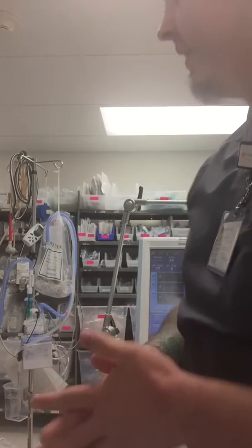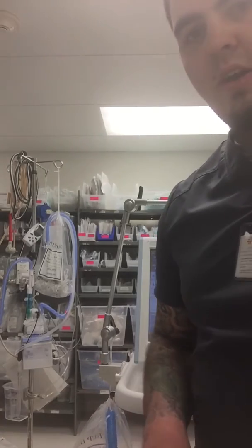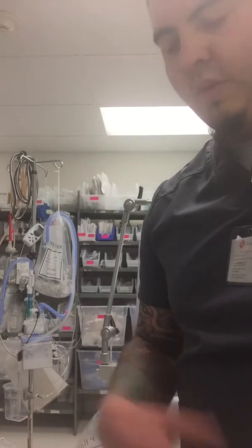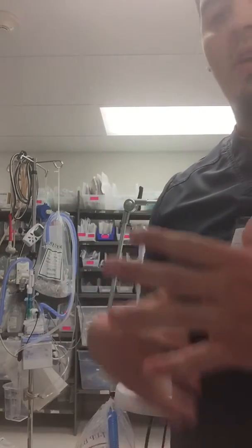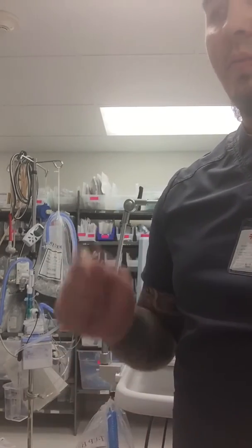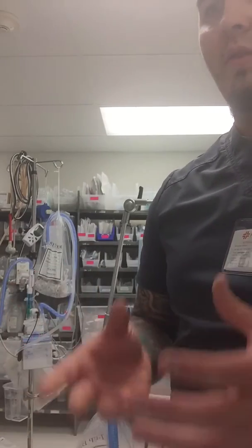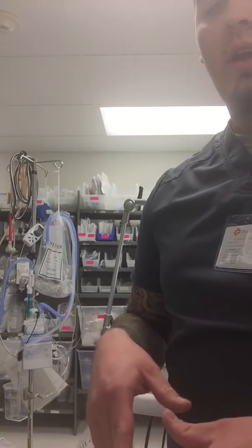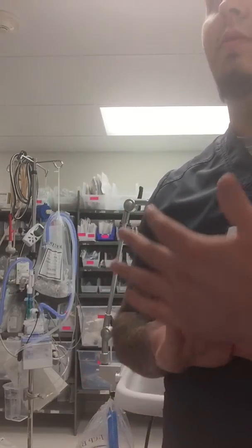I don't have that with me at the moment, and there isn't any spares in their supply closet, at least down here. So what you're going to basically do is put gloves on. You're going to use the swab which comes with a sort of solution to basically cleanse the mouth.